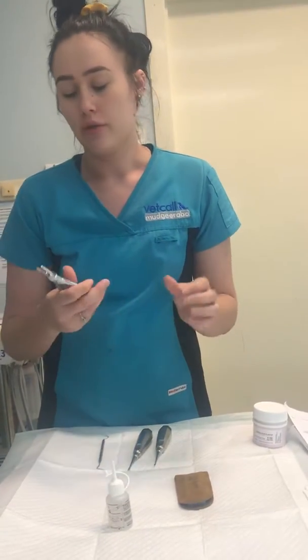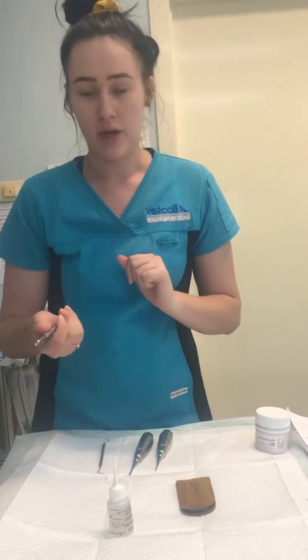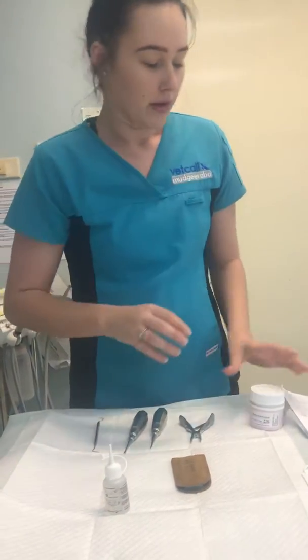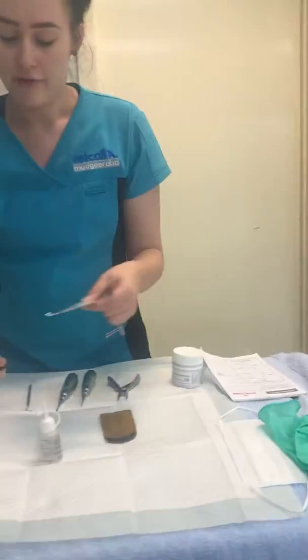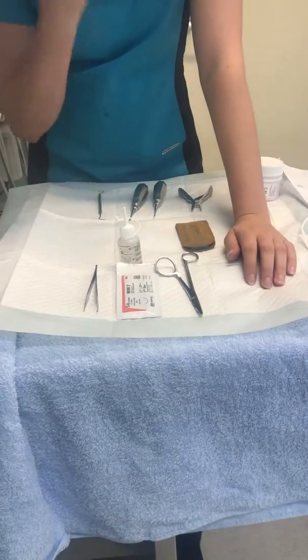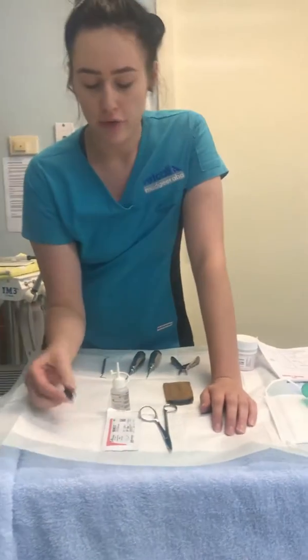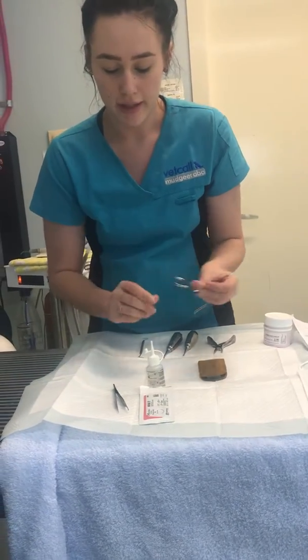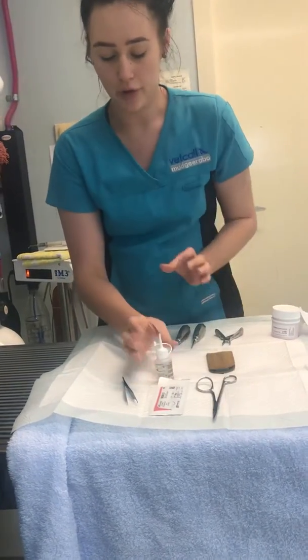And then because we are doing an extraction, we've also got both of these wingtip elevators, which is just to sever and move that periodontal ligament, which actually holds the tooth in place. And then last of all, you've got the extracting forceps to grasp that tooth and actually pull away from the bone there. And because we are doing an extraction, I have got the vet ready some instruments and suture material just to close that gum up. So just some rat tooth forceps and some needle drivers with the cutting ability there, and some 3-0 Monocryl suture material.